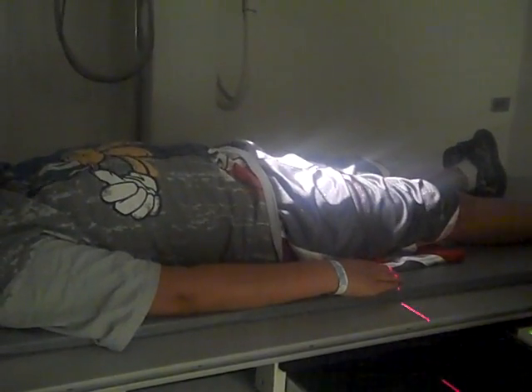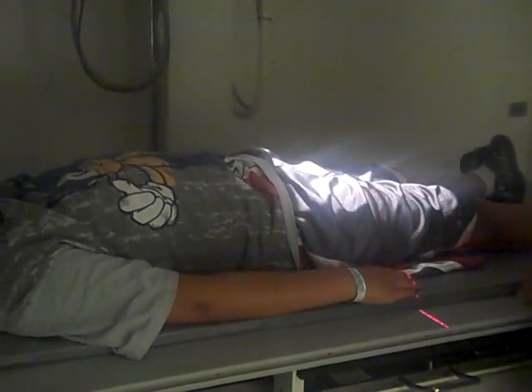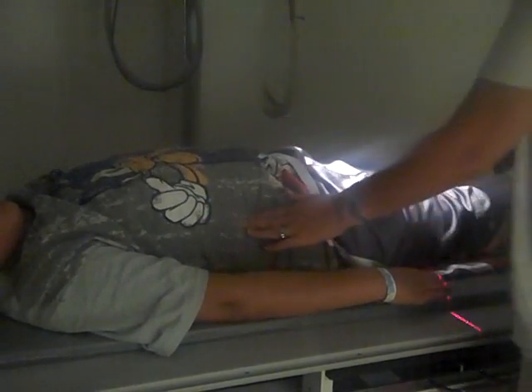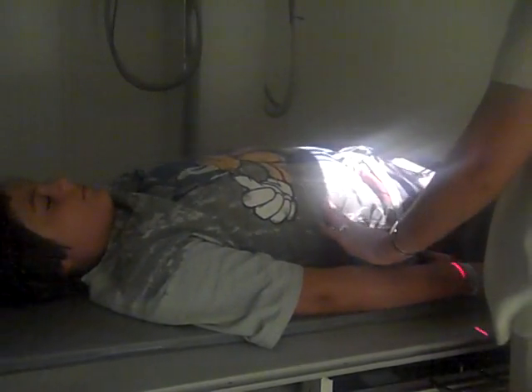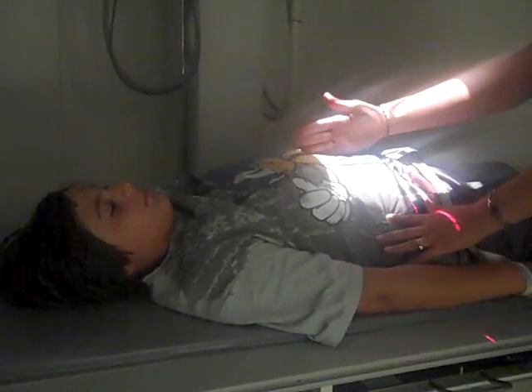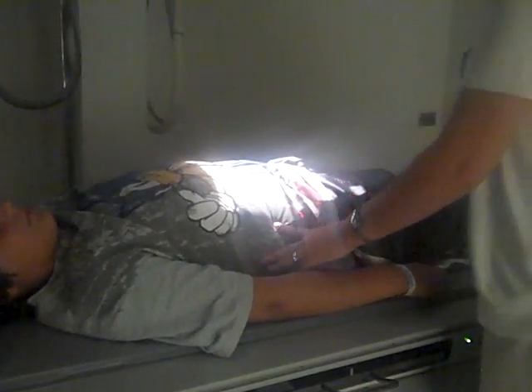When your collimator and your film are aligned you can push your film in. Next you're going to feel for the top of your patient's crest. So I bring my hands along the patient's side and feel for the top of the crest. I'm going to align this crosshair to the center of my patient and this crosshair to the top of the crest.